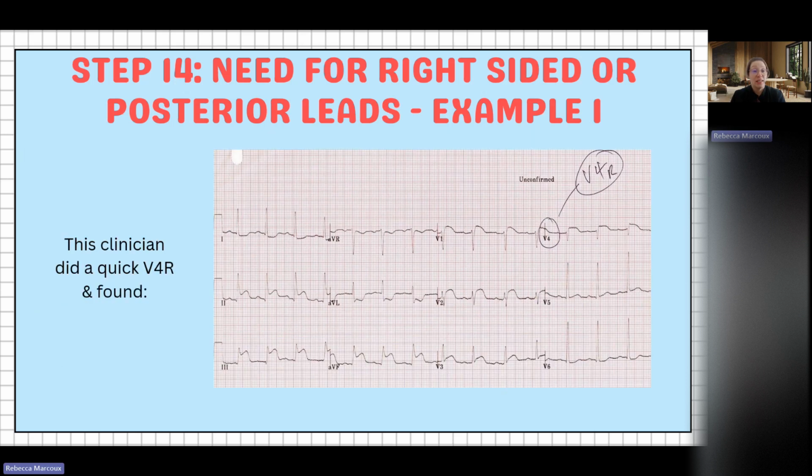So in this case, the clinician did a V4R based on our previous ECG. And what do we see in V4R?